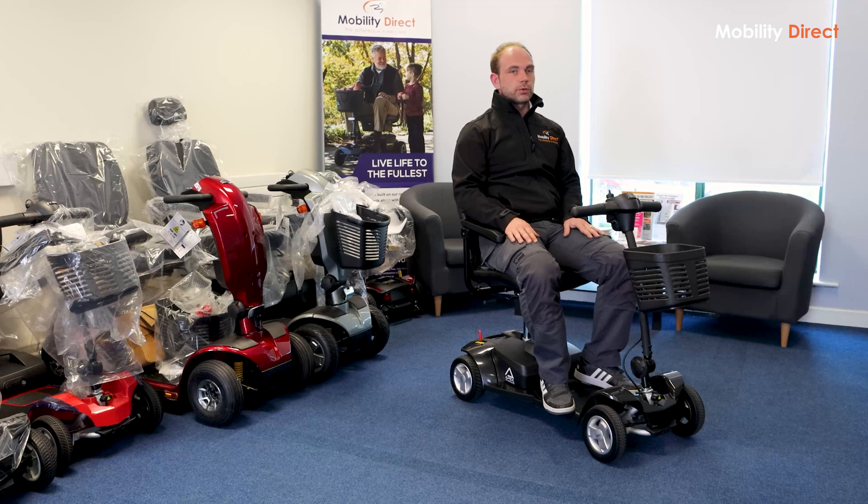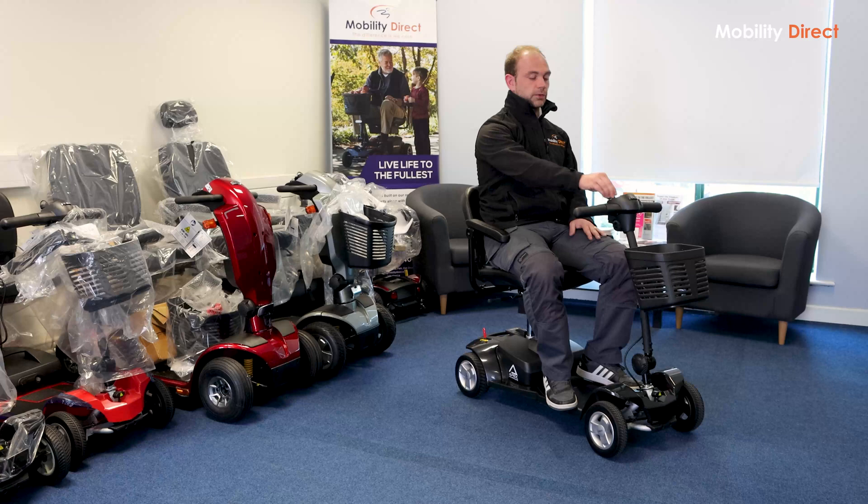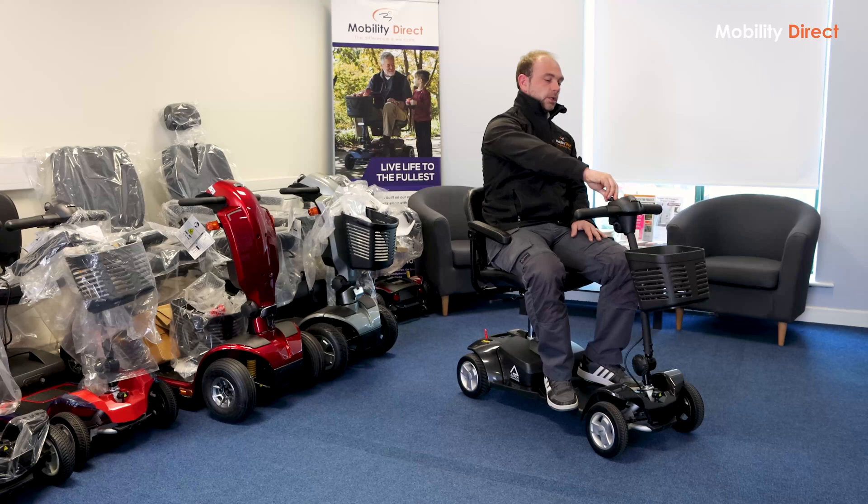Just on the key — if you are going to leave the scooter unattended, like outside a shopping centre for example, we would recommend removing the key. You just turn the key to the left and take it out. We'd recommend doing this if you are going to leave it unattended, just for safety's sake.